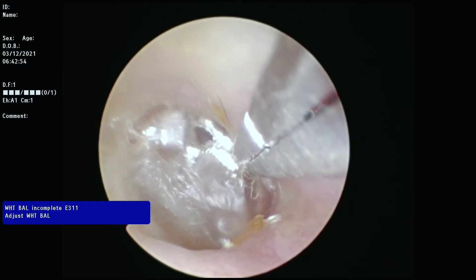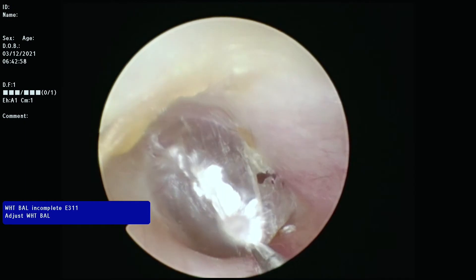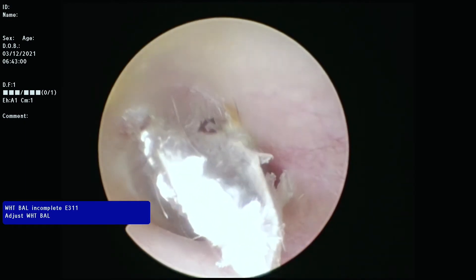In this video I am placing a tympanostomy tube in an awake patient in the office. The first step is to clean the ear of earwax and dry skin.